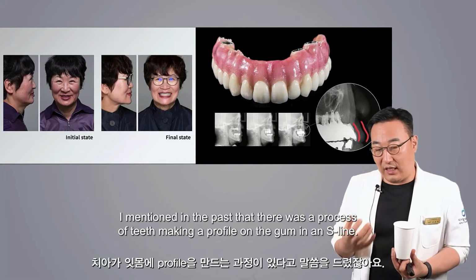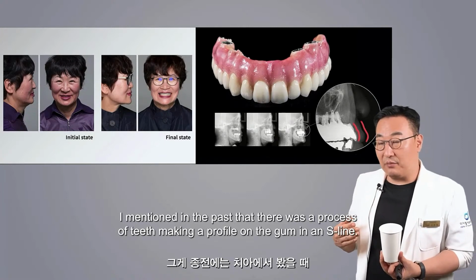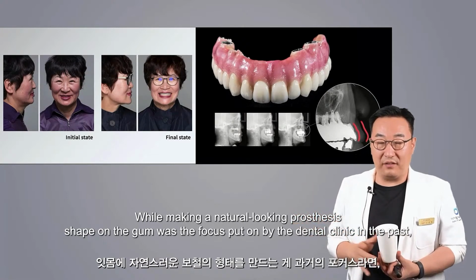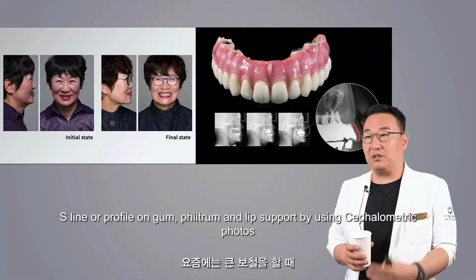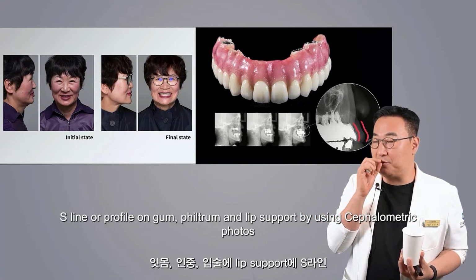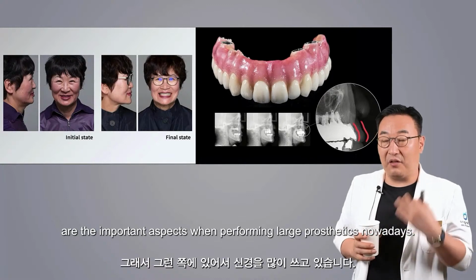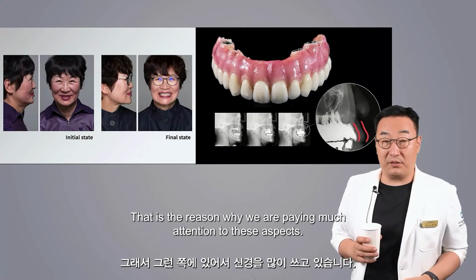I mentioned in the past that there was a process of teeth making a profile on the gum in an S-line. While making a natural-looking prosthesis shape on the gum was the focus put on by the dental clinic in the past, S-line, or profile on gum, philtrum, and lip support by using cephalometric photos are the important aspects when performing large prosthetics nowadays. That is the reason why we are paying much attention to these aspects.